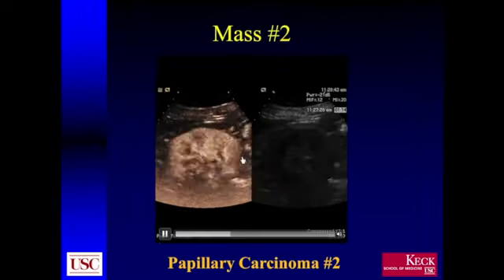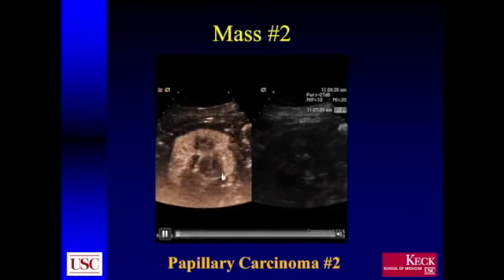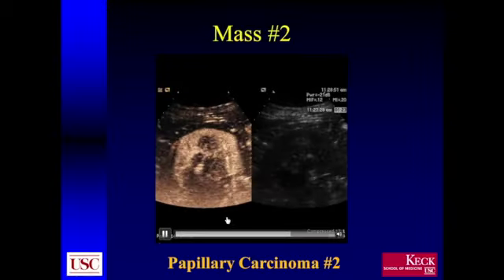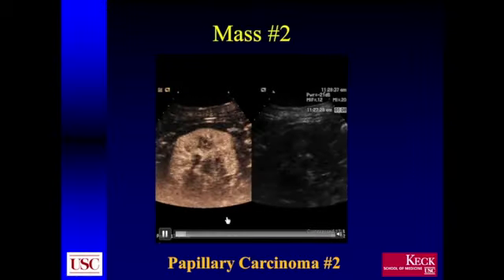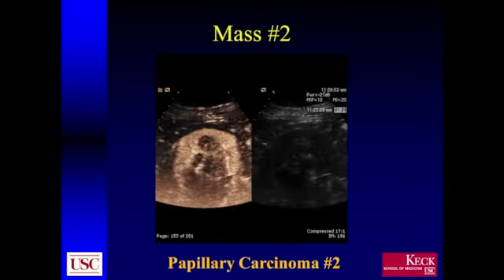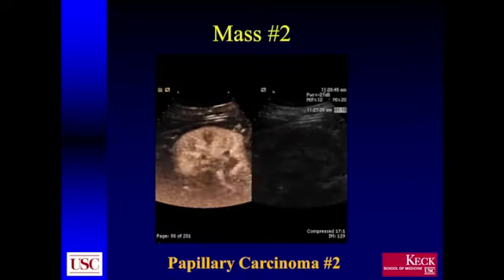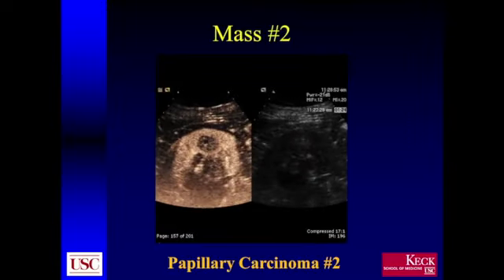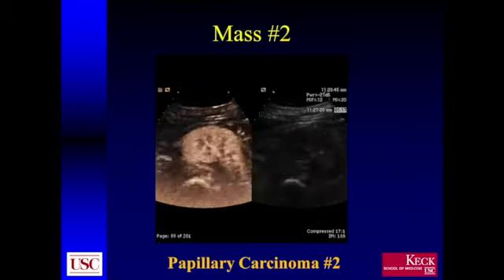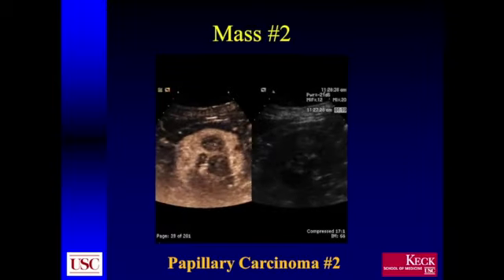In this particular case, you can see following the injection of contrast, there are two lesions which correspond to the masses identified on the recent CT. Following contrast injection here, you can clearly see that these masses enhance less than the surrounding parenchyma through all phases of the examination. But very importantly, they are nonetheless vascular, as opposed to those hemorrhagic cystic lesions we saw on the earlier patients.